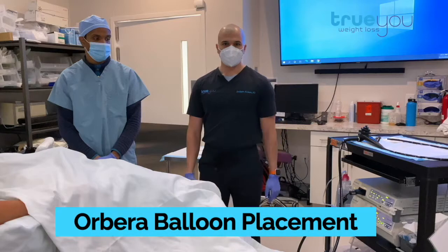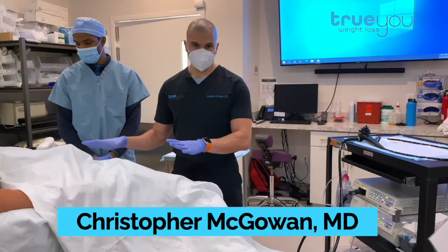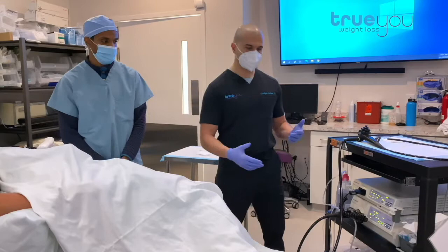We're doing an Orbera balloon placement today and we're going to demonstrate the entire procedure. Our patient has come in and we've given some light sedation with propofol, so she's nice and comfortable. We're going to start the procedure, which is going to take in its entirety about five minutes.